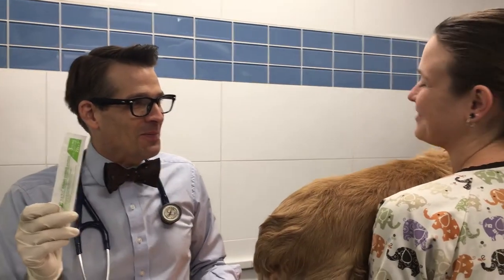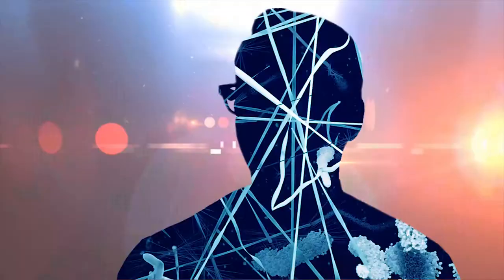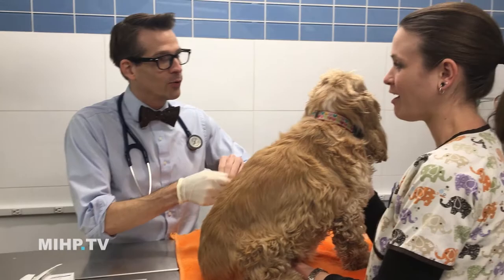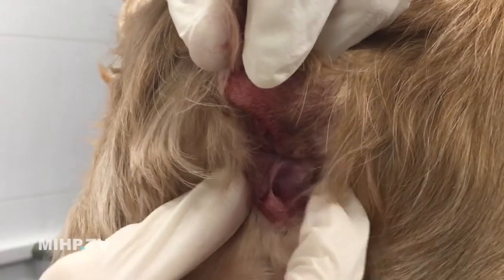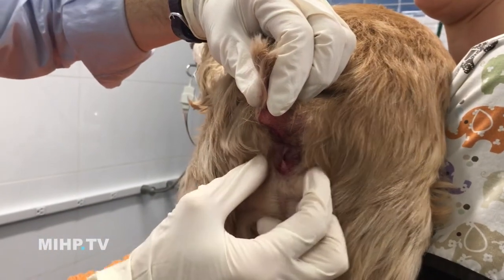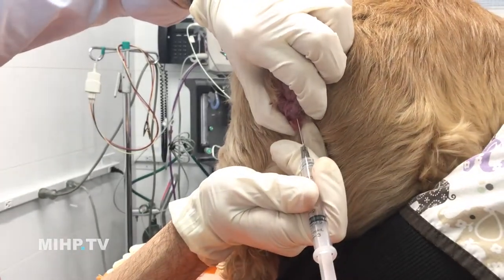The easiest biopsy there is is called an aspirate — we're gonna get an aspirate. This is Riley, also known as boyfriend. He's got a mass here right on the anus, which could be a cyst or it could be an infected something. We're not going to take any chances — I'm gonna go right in here, one, two, three, poke.